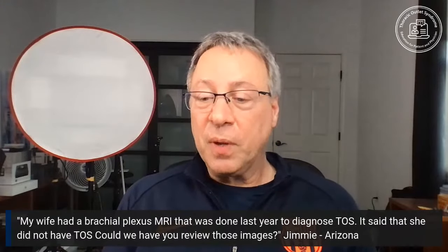Next question says, are you still performing your unique MRI for TOS during the pandemic? Thank you. Yes, we are. We are fortunate to have some very good imaging partners in different parts of the country. All of them have taken suitable precautions. I've not heard of anybody getting the virus at one of these centers. They've spaced out their schedule so that there's more time between each patient. They wash down and sterilize the rooms, disinfect the rooms that they use. They disinfect the MRI scanner inside and the coils that they put on your body. So I think we all feel safe that we can scan patients during this period.